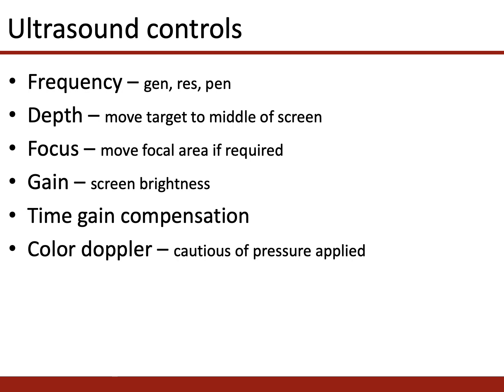The next button to be aware of is the gain button. Now, the gain button can confuse people, but what it means is the screen brightness. So remember, it's ultrasound. We are dealing with the time and the amount of ultrasound that's reflected. So this increases the brightness of the screen as a whole.